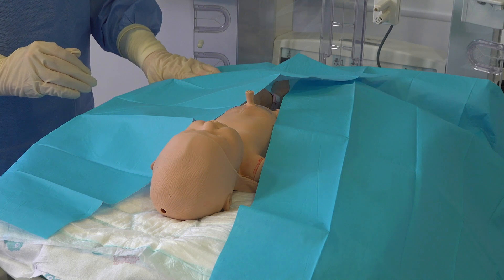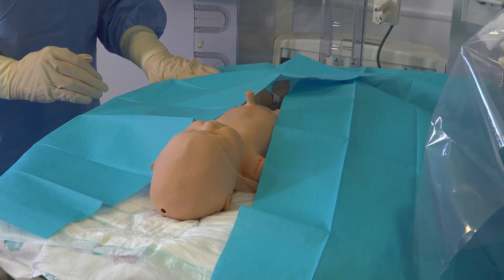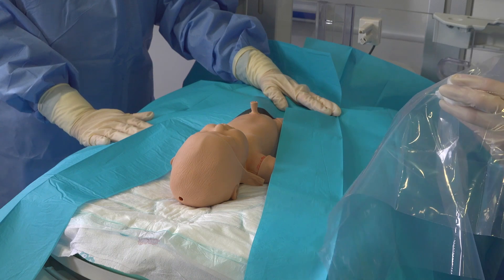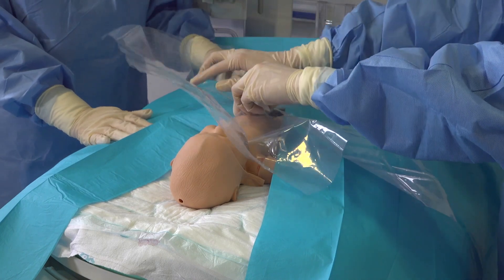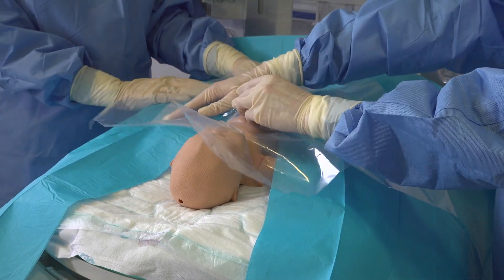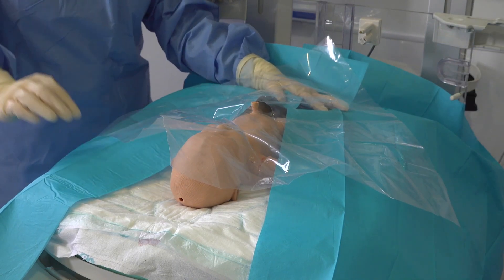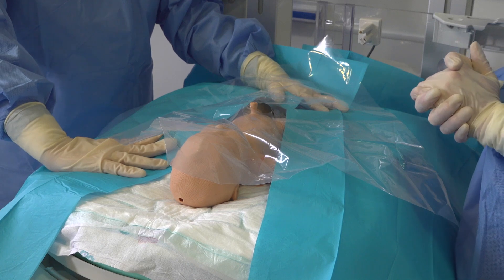Once this is done I remove my top layer of gloves. We now put our additional drape over the top. When you have your cord tie in situ I take gauze in my left hand holding this while I place the drape over the baby. You now have a fully intact sterile field and are able to begin your procedure.